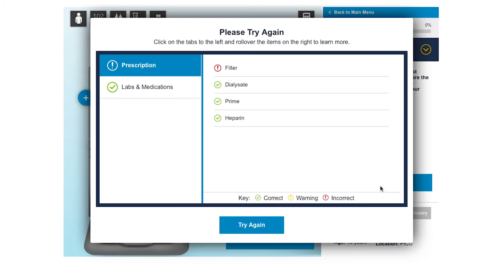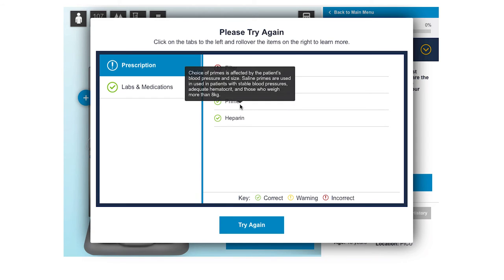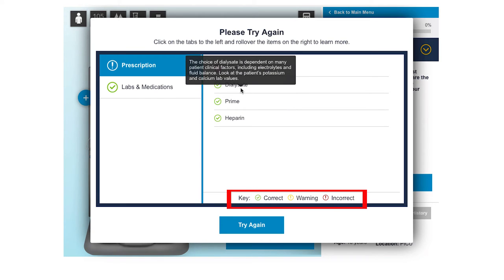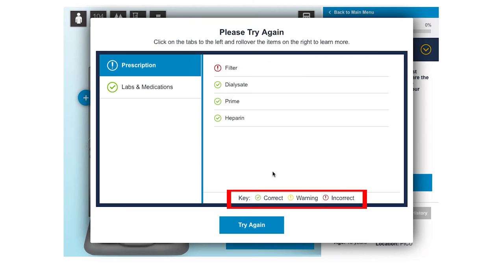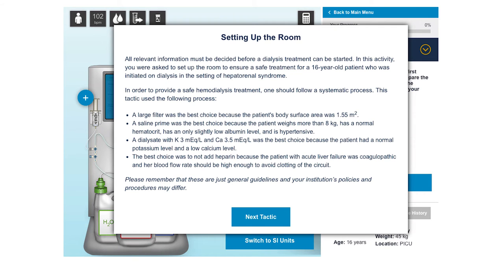Next, feedback is given with the details offered when the learner scrolls over the possible actions. Green check marks indicate correct actions, yellow indicates an action that could have been improved, and red indicates incorrect actions. An end-of-activity feedback is also given to outline the key learning points.